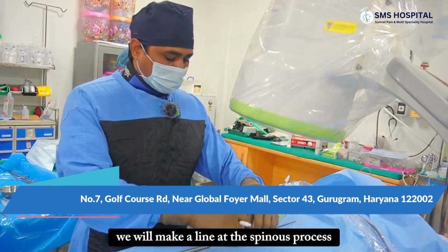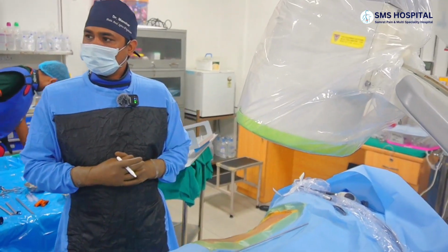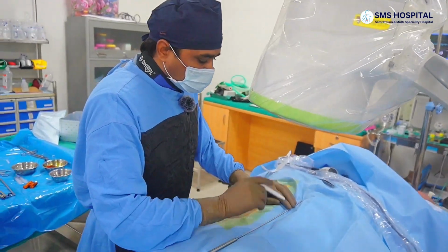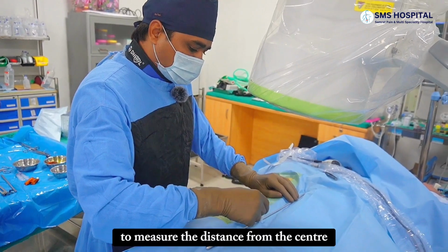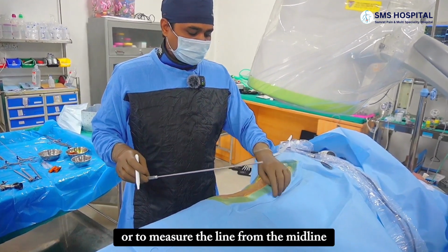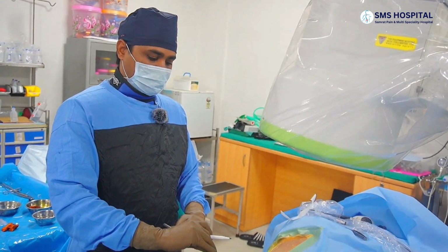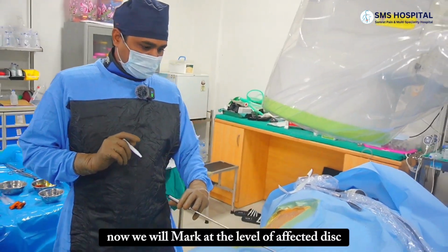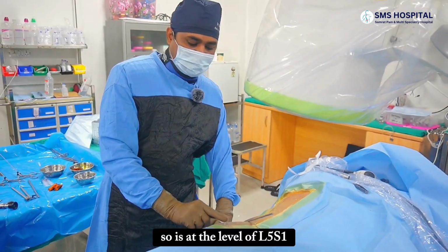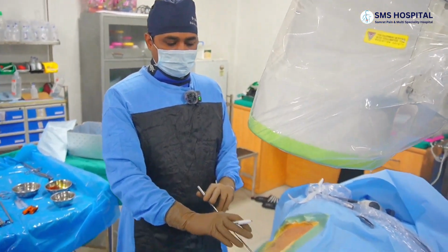Second, we will make a line at the spinous process. We are marking at the spinous process to measure the distance from the center, or to measure from the midline. Now we will mark at the level of the affected disc, so it is at the level of L5S1.